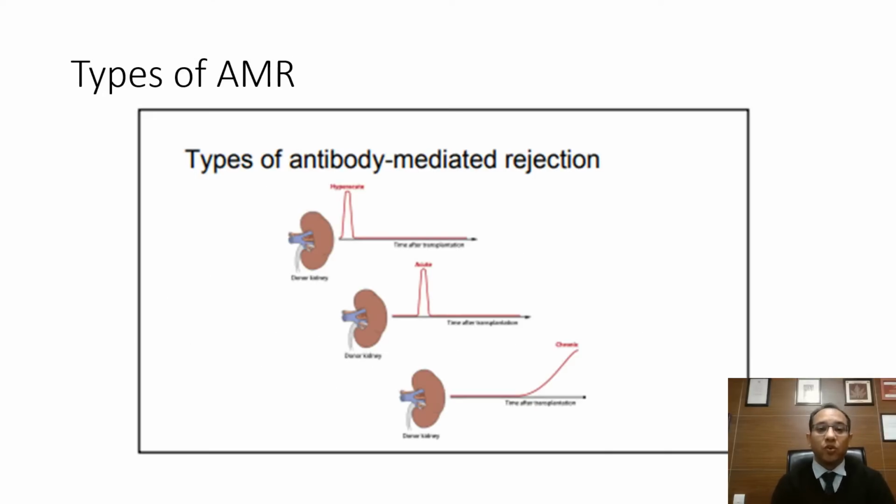So what are we doing? We are trying to detect the antibody-mediated rejections by doing this virtual cross-match or physical cross-match. One of the cross-matches, Luminex cross-match or Luminex DSA or Luminex lysate-based donor-specific antibody test, which we are going to discuss today.